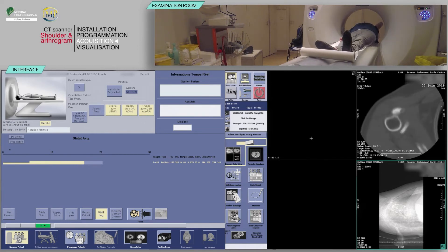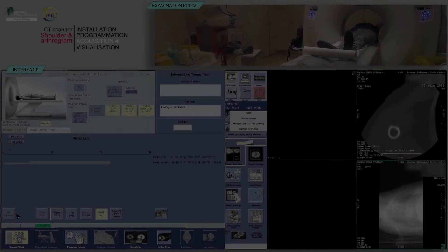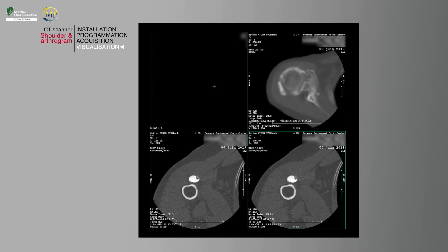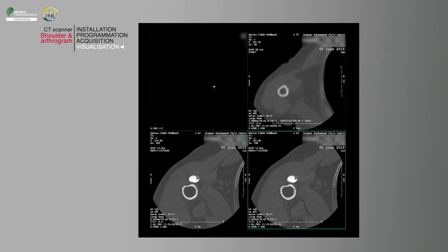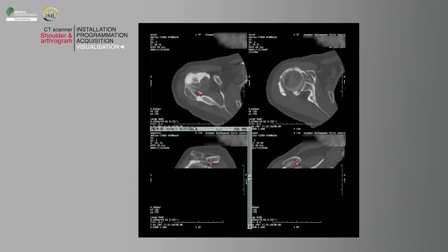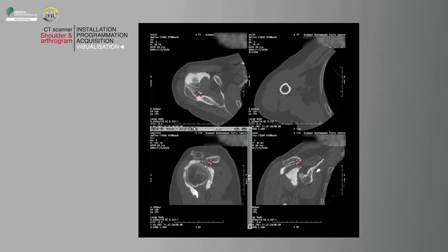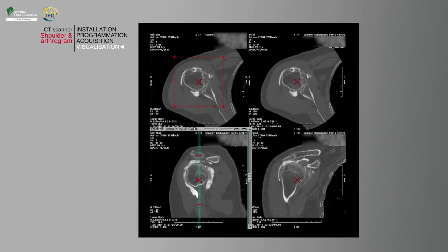Verify the absence of patient motion on the acquisition. After clicking on End Exam, you can perform a multi-planar reconstruction according to planes requested by the radiologist. In a trauma case, it is possible to reconstruct a 3D with a volume rendered reconstruction.